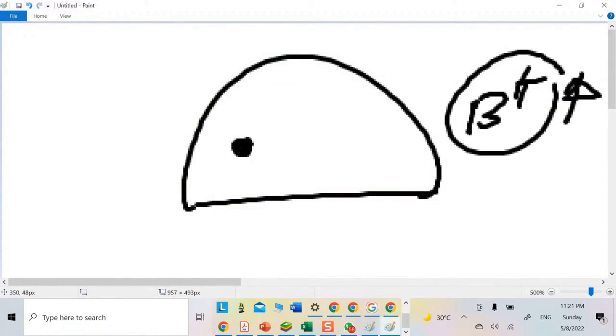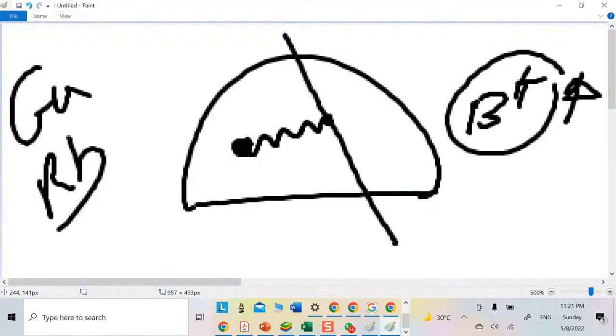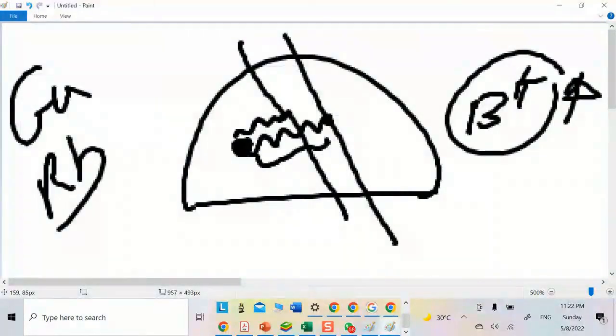Large. This is what happens with gallium-68 and rubidium, where the energy of their emitted positrons is high, allowing the positron to travel a greater distance before annihilation occurs. In contrast, with FDG, for example, the distance is small, so annihilation happens closer to the source. Consequently, this affects the resolution. Of course, this distance is in millimeters, just so no one thinks it's large, as I mentioned.